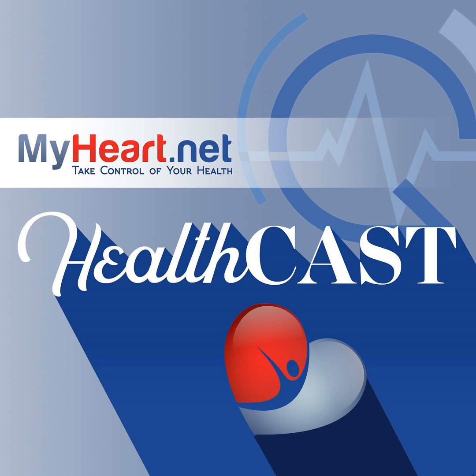Well, particularly with myocardial perfusion imaging, when you use thallium, the dual isotope, the radiation really gets to 20 to 23 millisieverts. Therefore, there's an advantage of using other protocols, primarily with technetium, where you can reduce patient exposure to radiation.